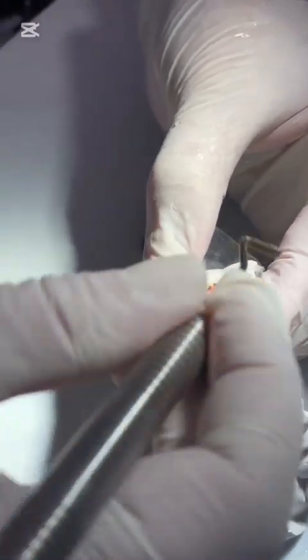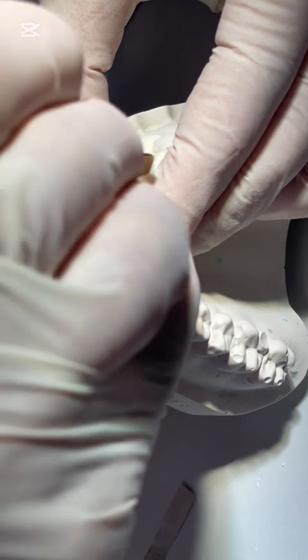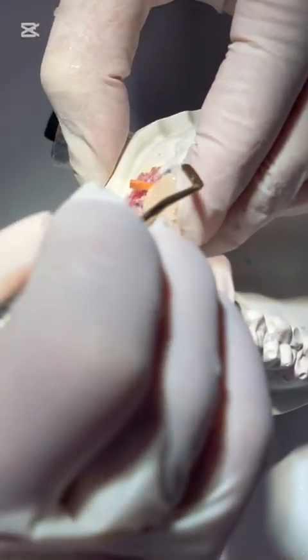So you're using your finger to put pressure on it? Just to stabilize. Can you see, guys?